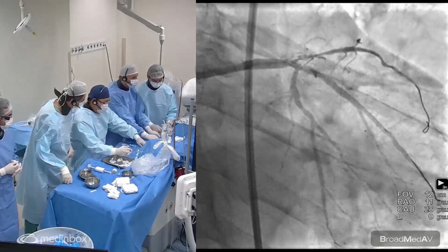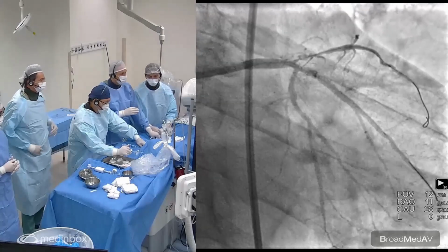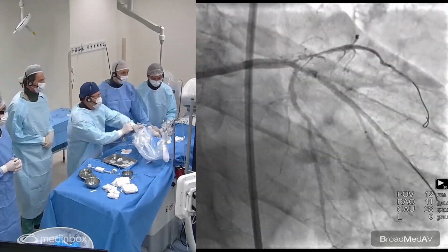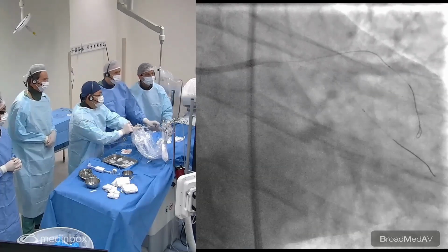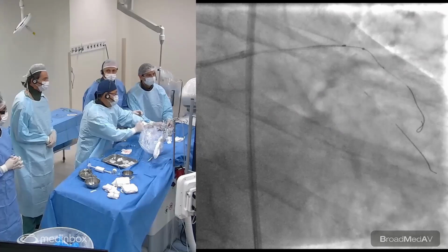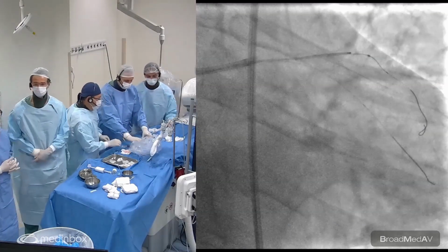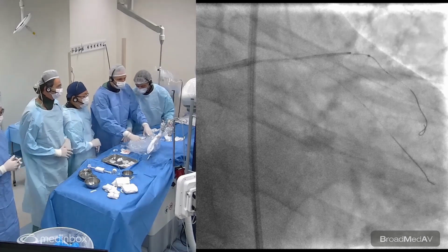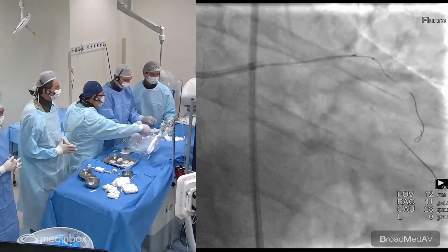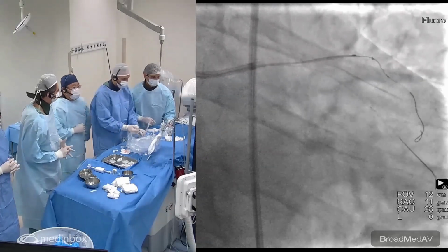Minas Gerais. So the control angio here, we can see a lesion that is relatively long. And we are going with IVUS now, which is very helpful at this stage to see the real extension of the lesions. It's going to be guided by IVUS, imaging live. But do you think we need IVUS in this LAD prior to placing the stent, Rodolfo, or no?